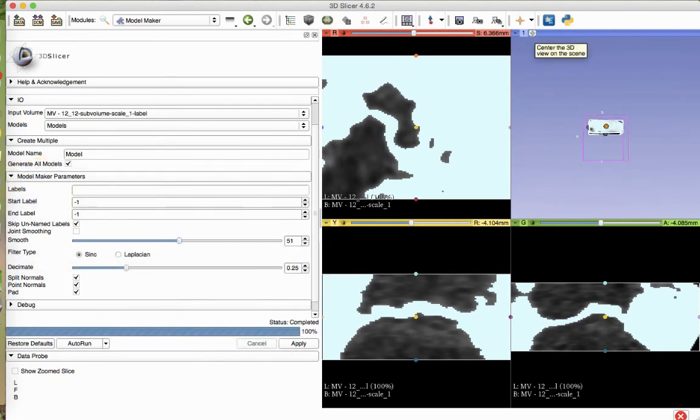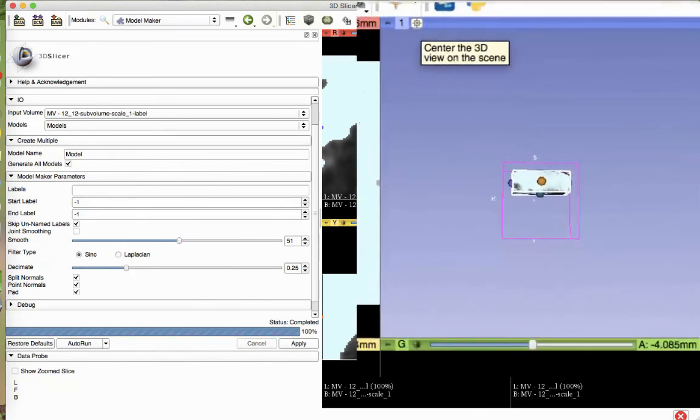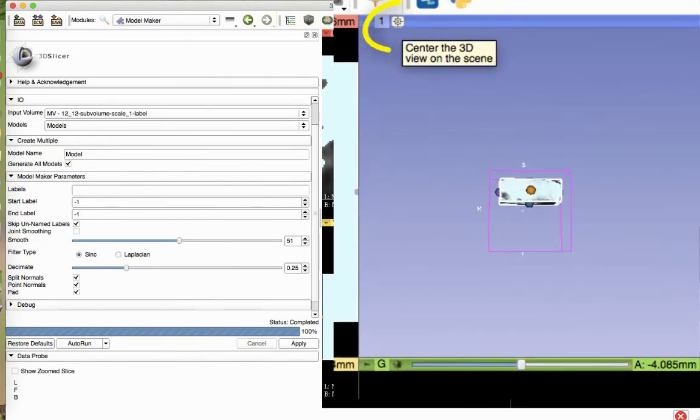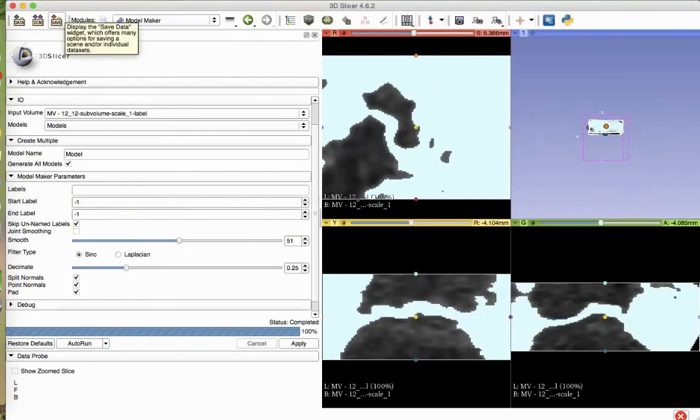The model will appear in the blue box of the 4-up viewing window. In the blue box, click the Crosshair button to center the image.